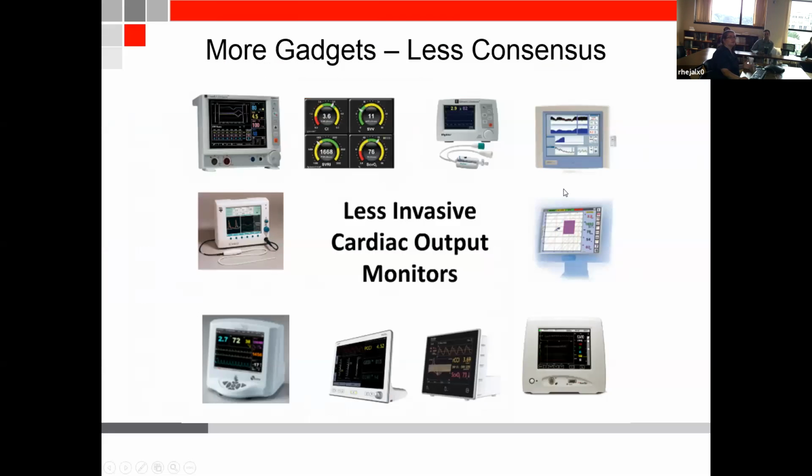All of these exist, we're not going to buy them all. I'm just arguing for getting one pulse contour analysis device, so we have at least 2 modalities to work with.